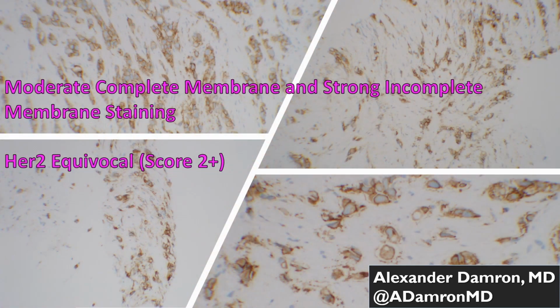So now let's show the upper end of HER2 2+, right? And this is a case where you say, wow, some of this looks pretty strong on low power. And if you look, that's nice and crisp. You're really approaching the upper end of 2+ in this case.